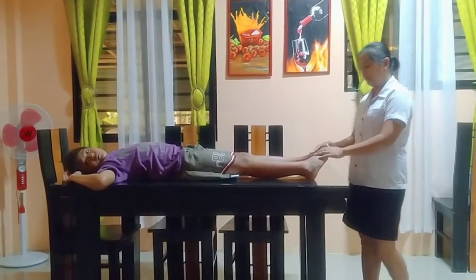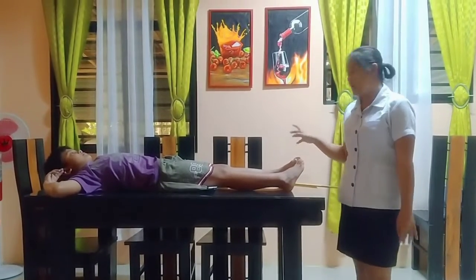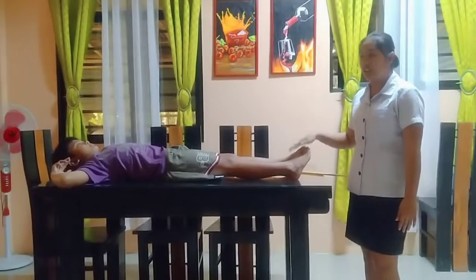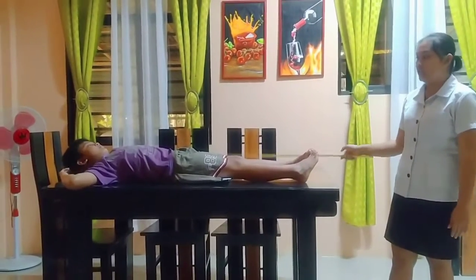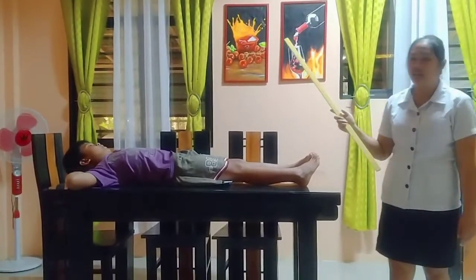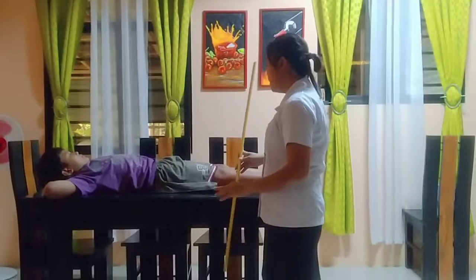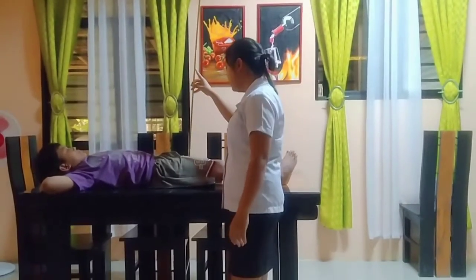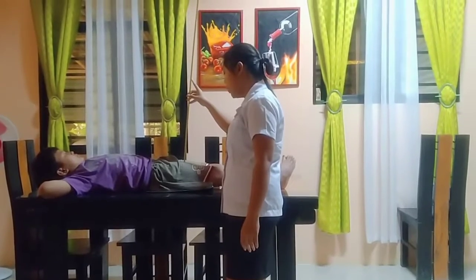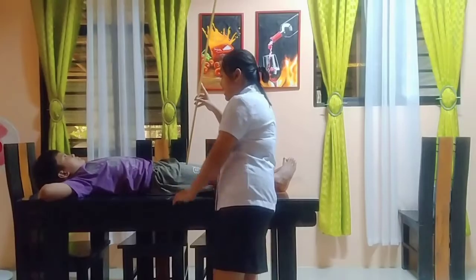So, yan po. If the patient has a suspected injury, wag na pong gawin ang rotation of the foot. So, the central ray will be perpendicularly directed at the center of the femur or the midpoint of the IR.